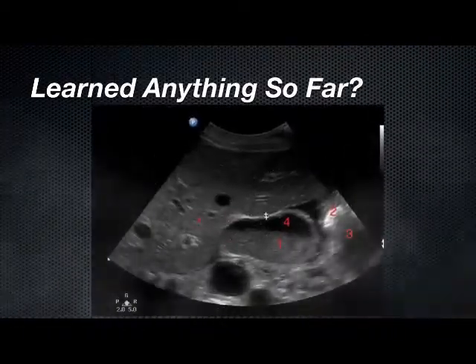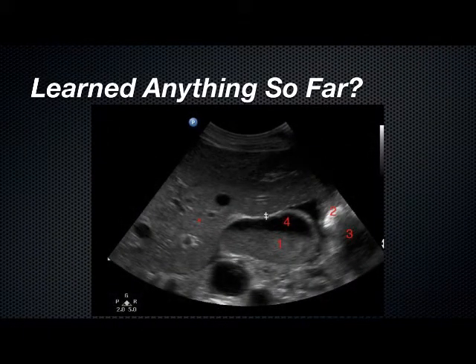So just take a quick look at this, and I want you guys to pay attention to how you would describe each of these different areas. When you look at area number 1 and compare it to the area that has the asterisk, the area that has the asterisk is actually the patient's liver, okay? The stuff that is gray, almost the same shade as the liver, is what we call sludge inside the gallbladder. So sludge in this case is isoechoic or hypoechoic in relation to the liver.